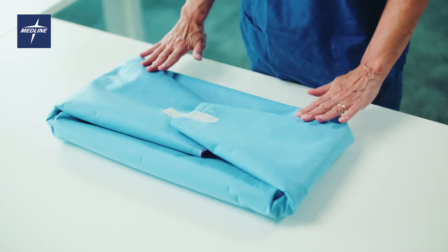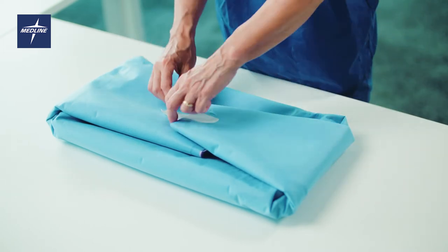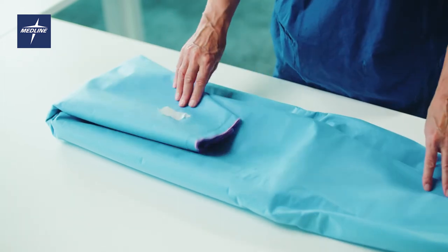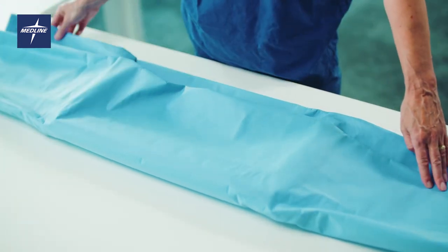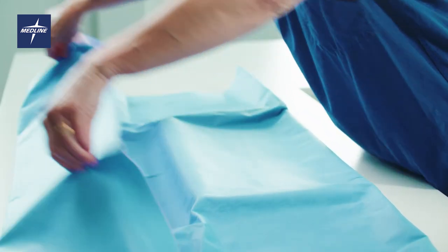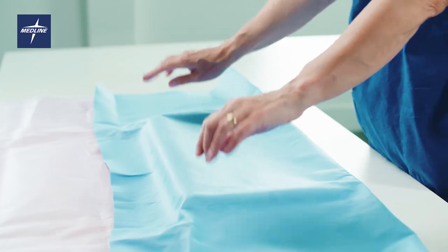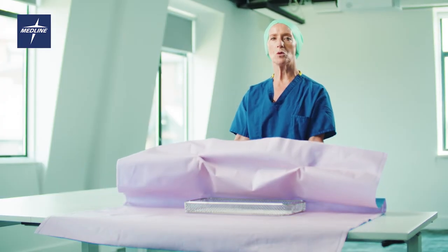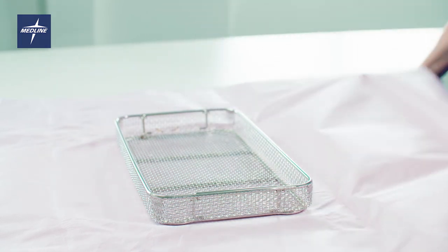With the fold of the set towards you, break the tape, unfold the wrap to the sides, open the tray wrap away from you, finally pinch the tray wrap at the corners of the instrument set, fold back towards you to expose the sterile field.